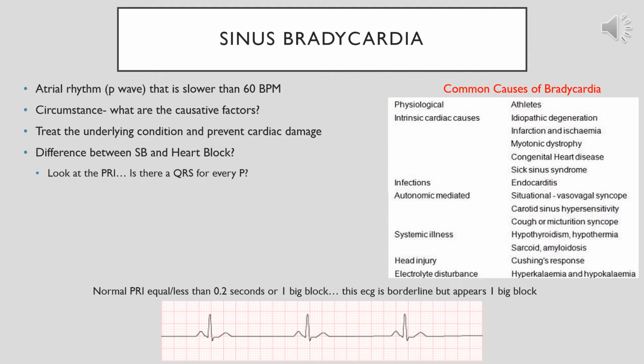When we're looking at whether this is shockable versus not shockable, this is not a shockable rhythm. What is the rate? Okay, if we're looking between our P waves or QRSs, it looks about 1, 2, 3, 4, 5, 6, 7, 8. It's about 8 big blocks in between. Let's count another one. It's about 8 big blocks between the third beat as well. So we'll take 300 divided by 8, and that's about 38 beats per minute. So this is a significant bradycardia.